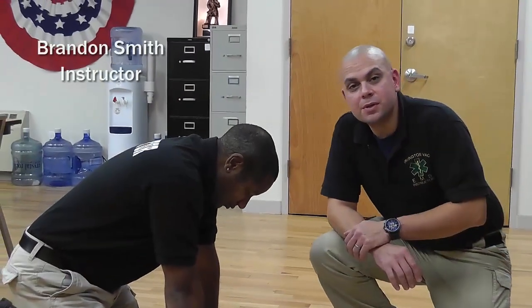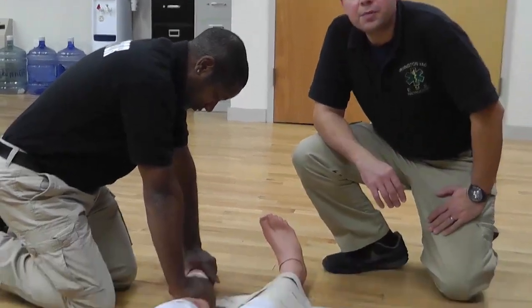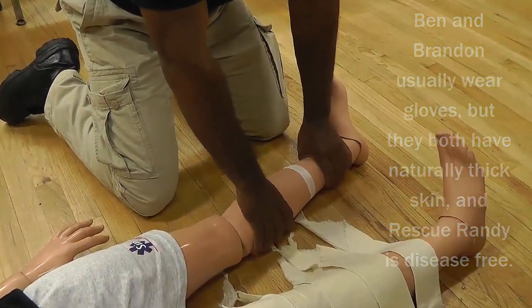Right now, Brandon is holding stabilization of the injured leg and you can see the injury clearly marked by the piece of medical tape I placed on the leg. Let's get started. I work with my cravats.